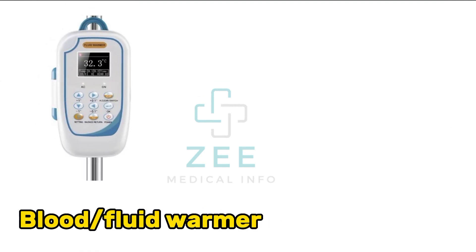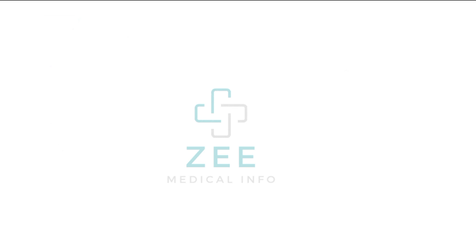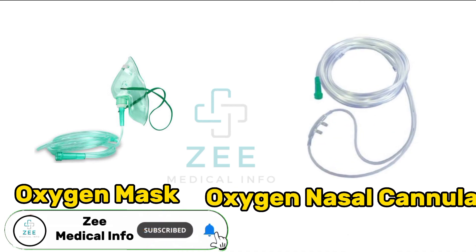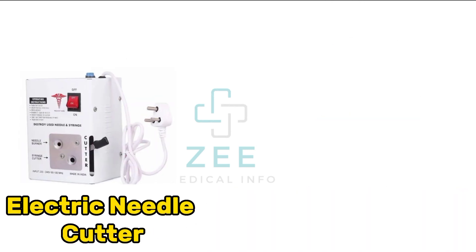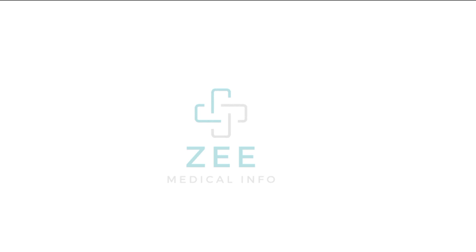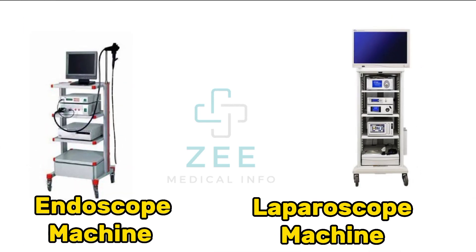Fluid warmer, glucometer, oxygen mask, oxygen nasal cannula, electric needle cutter, vein viewer, endoscopy machine, laparoscope machine.